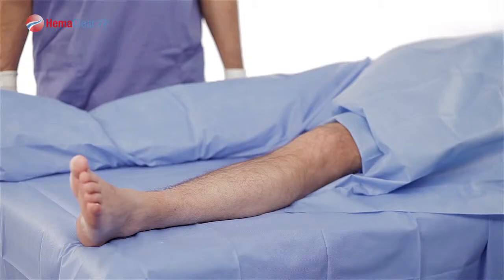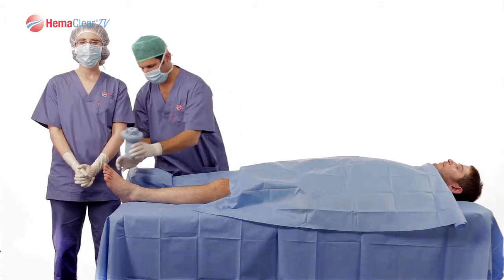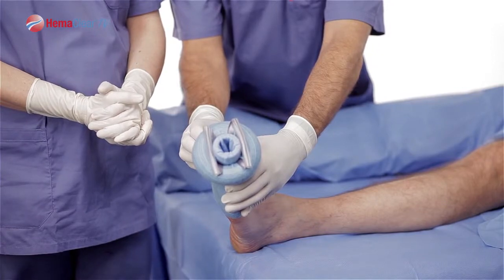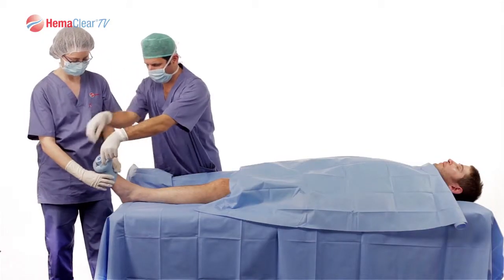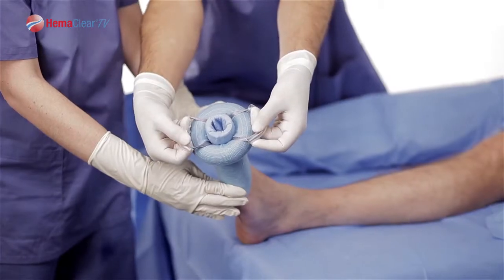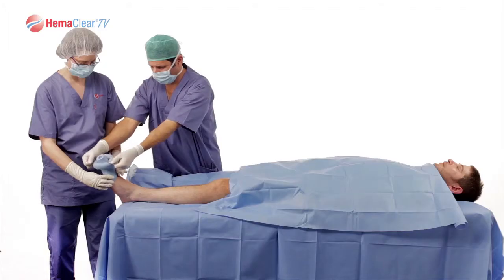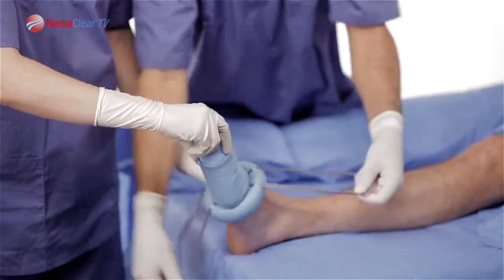Place the patient's leg flat on the table. Place the patient's toes within the Model A cup, or have your assistant do so. Next, the surgeon should hold the handles of the Hemoclear so that one handle is directly over the toes and the other handle is placed over the heel. Pulling the handles, advance the Model A to midfoot.